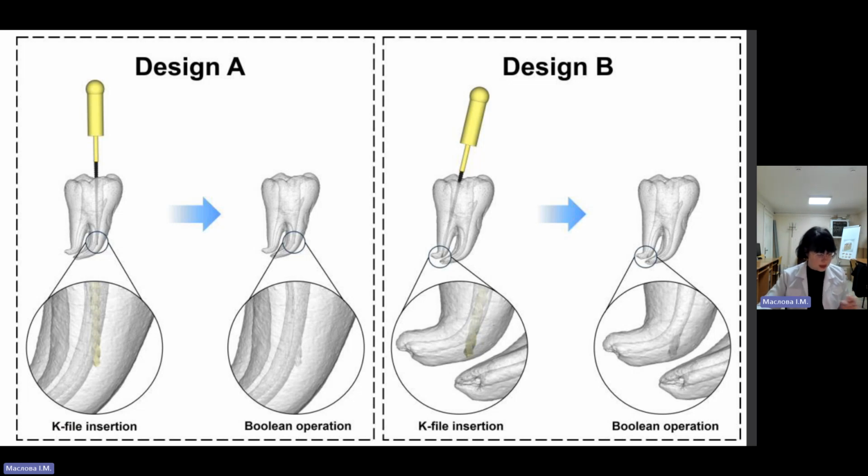Preparation for treatment. Preparation for endodontic treatment entails the establishment of the root canal to be treated in an antiseptic field of operation. It consists of the preparation of an adequate access cavity, the secure placement of the rubber dam, and the disinfection of the rubber dam, the tooth, and the pulp chamber.